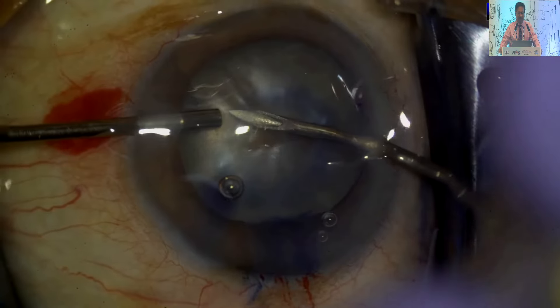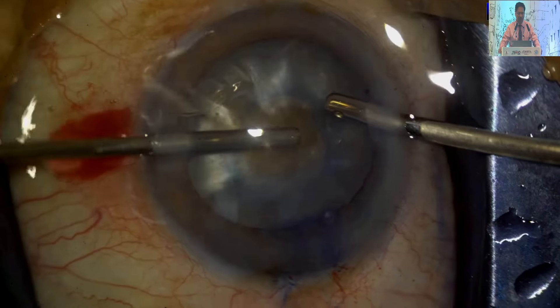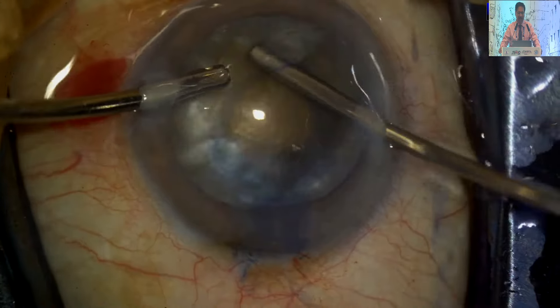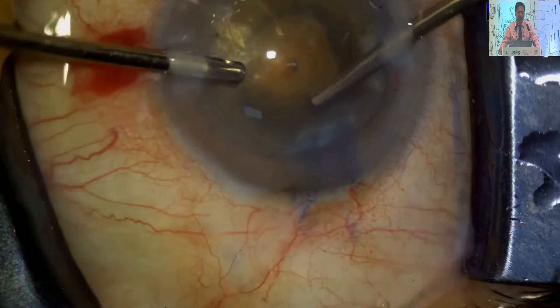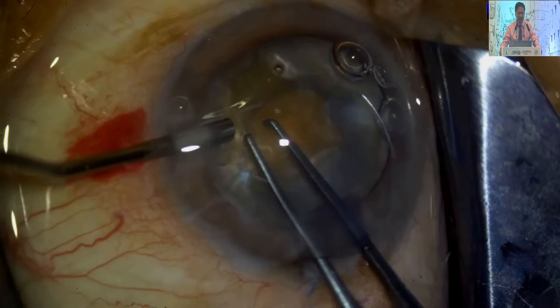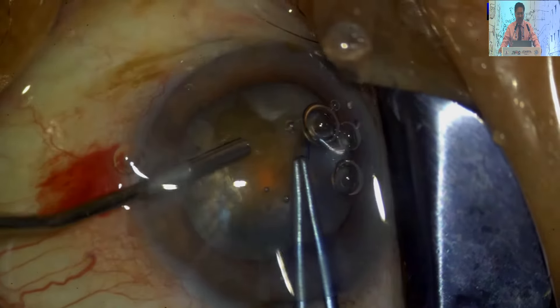This is an older video — the same technique: two side ports, one for aspiration, one for pouring viscoelastic simultaneously. Concurrent action is very much required. Otherwise, you can encounter Argentina flag sign at the time of puncture only. So you have to be cautious — you have to pour the viscoelastic so that the anterior chamber is well maintained.